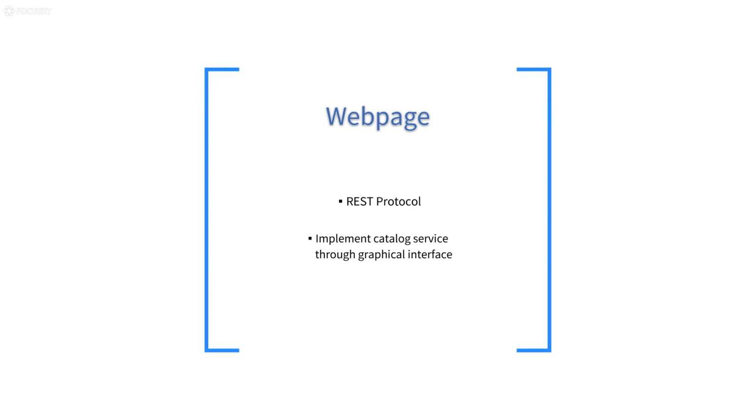The web page consists of several sub-web pages. Users can use the web page to add user and medicine, delete medicine, and do other simple operations. If we want to know some underlying details, it's possible to use web pages for managing the platform, like modifying the IP address of the broker or managing the registered devices.